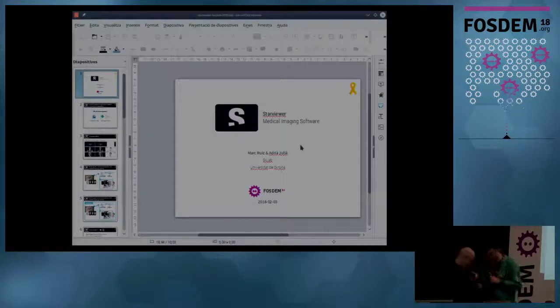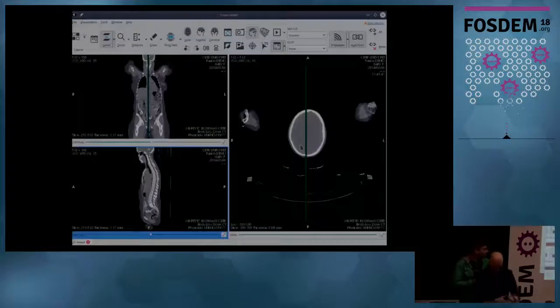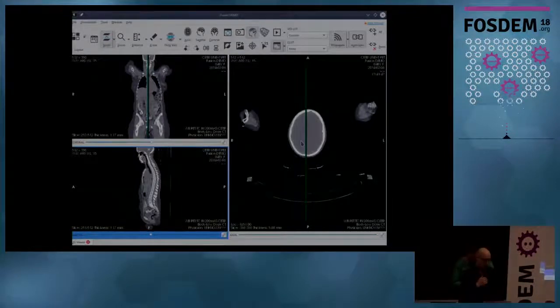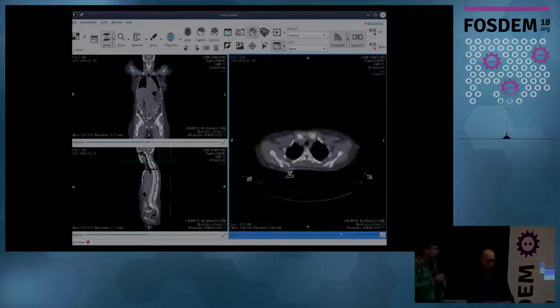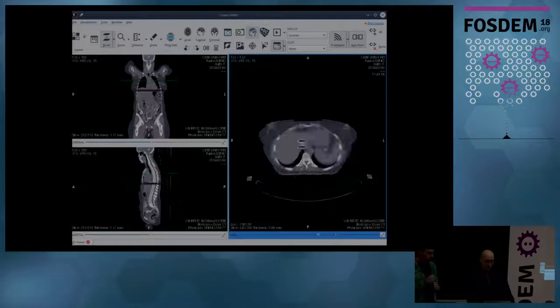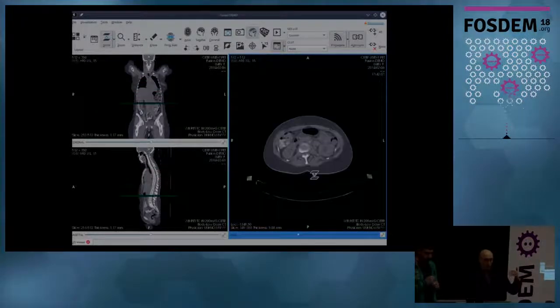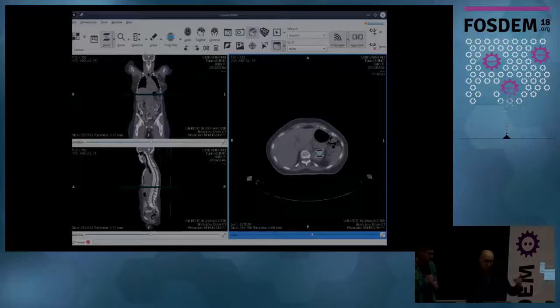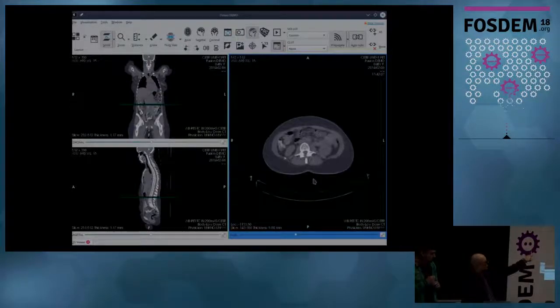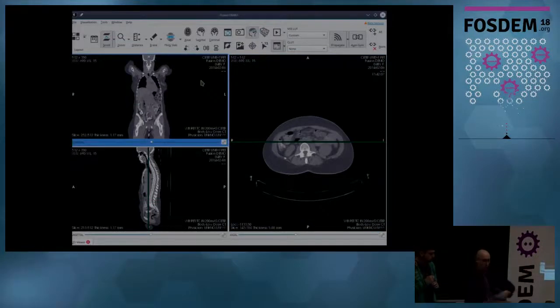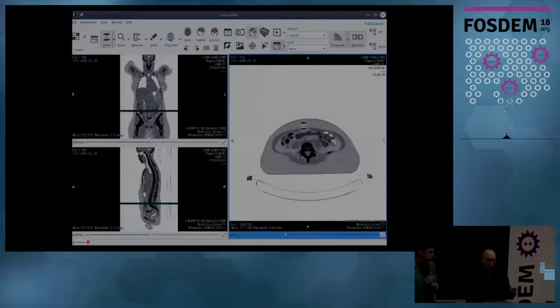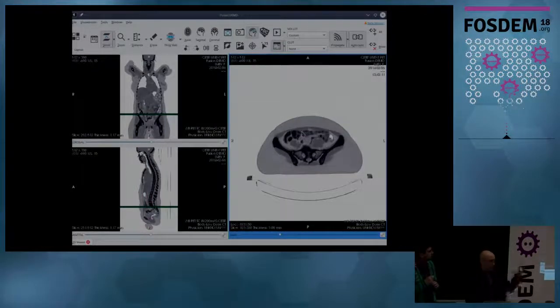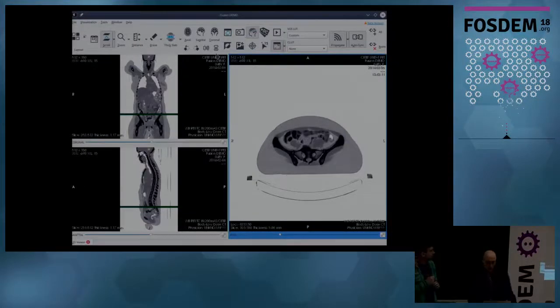Here is the StarViewer main window. And one of the things that radiologists usually do is what's called slicing. Slicing is changing the slice. And as you can see, as I change the slice, this green line, you can see here, moves to show the slice you are seeing right now. I will invert the colors because I think it will ease your task of viewing this. These are called reference lines.